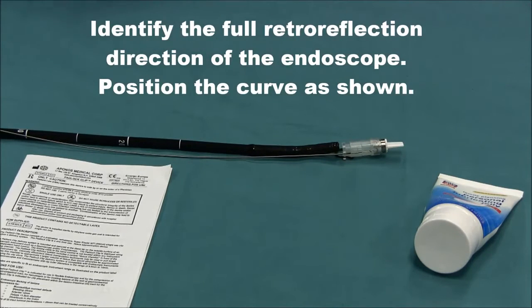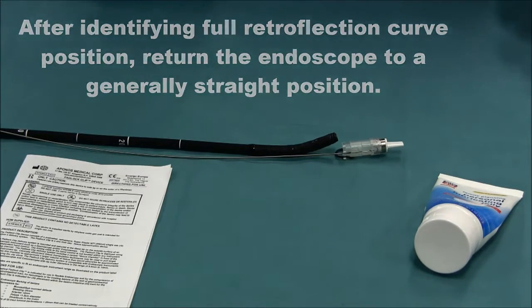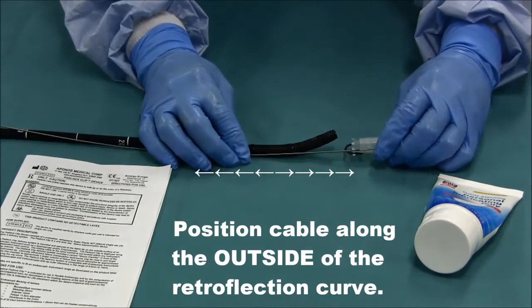Identify the full retroflexion direction of the endoscope and position the curve as shown. After identifying the full retroflexion curve position, return the endoscope to a generally straight position. Position the cable along the outside of the retroflexion curve.